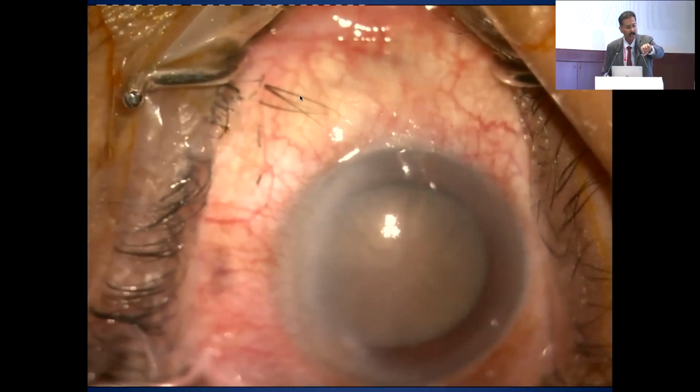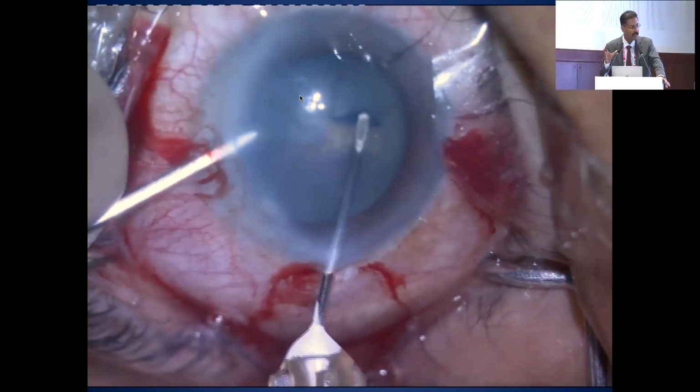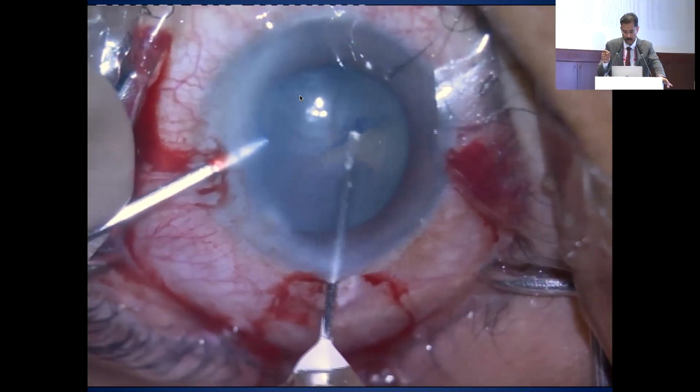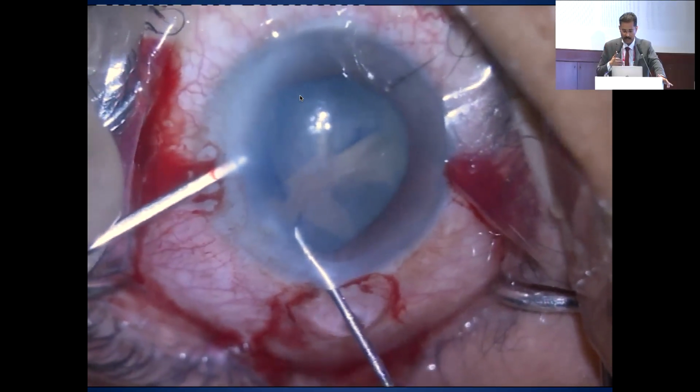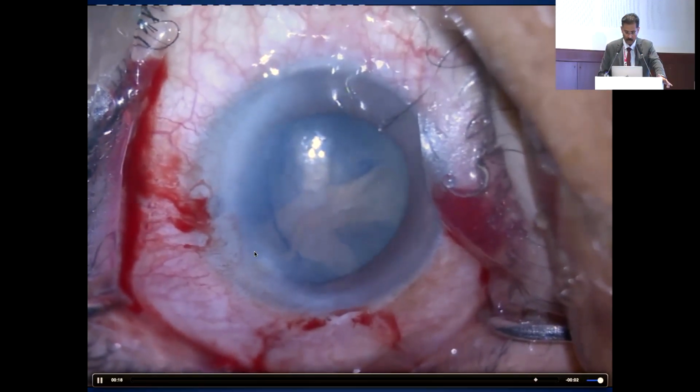So just to relax towards the end, when trainees start doing this with hesitation, this kind of hypermature cataract, see, it has started going towards the periphery. It is very, very gently, slowly trying to pull, it keeps on going to the periphery, so I decided to retract, and cut once again, one more cut. Now it is looking like 1, 2, 3, 4.